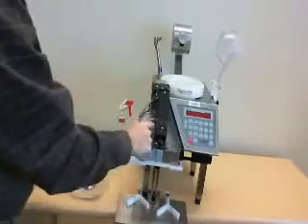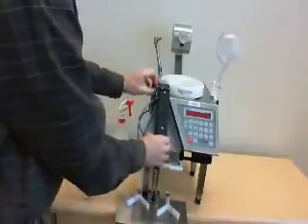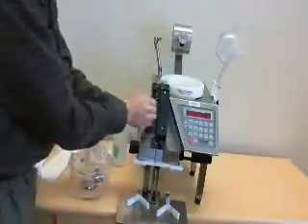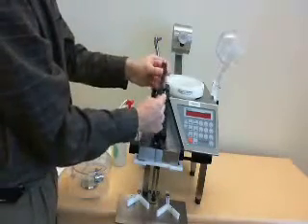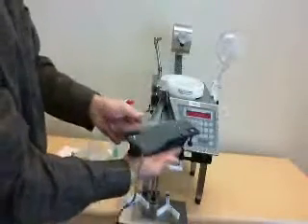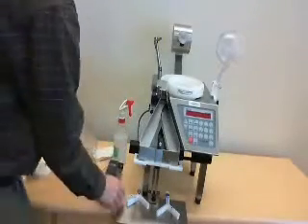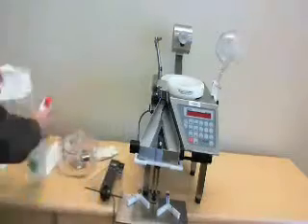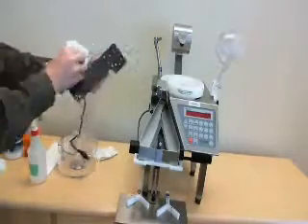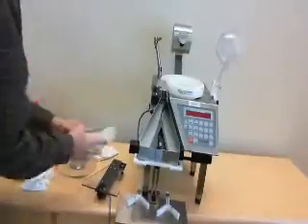Now we will clean the counting sensors and the pill path area. We're going to start with removing the 2 thumb screws of the cover of the counting sensor, and also gently remove this electronic component. We're going to always place this on its back on a flat, clean surface, so we do not scratch the surface. Cleaning solution. Clean this section off that can be exposed to tablet dust. Clean and dry as you go.